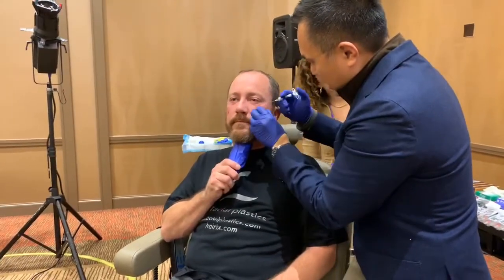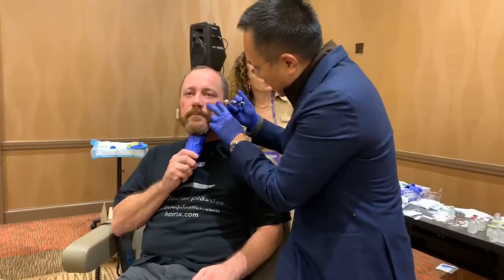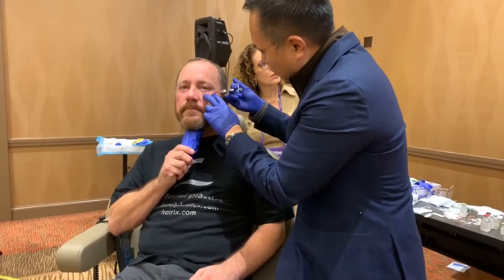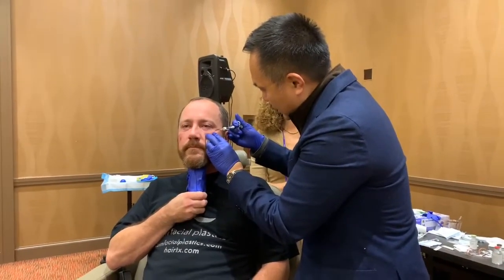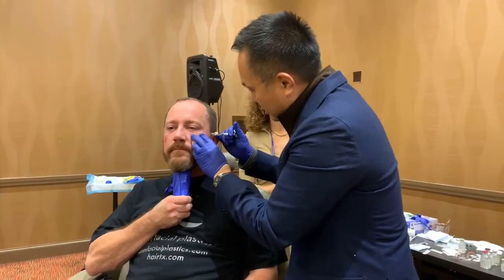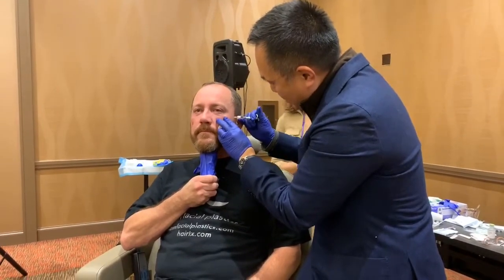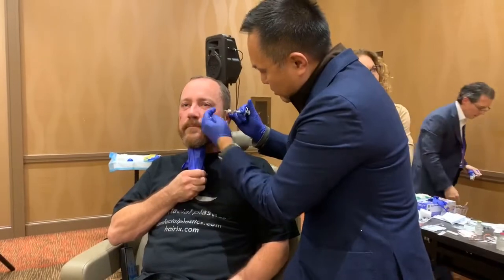My best point of reassessment — though I don't think it's as critical for him right now — is to have the patient go to the front and look. He's getting a little edema, so you're starting to see the line come back; you don't want to chase that edema. I always caution patients about pre-existing asymmetry. I tell them I fix about 80% of the asymmetry, and the last 20% they think I actually created. Despite that, patients come back every single week saying 'Doc, I think you made one side bigger than the other' — and I always show them the befores.